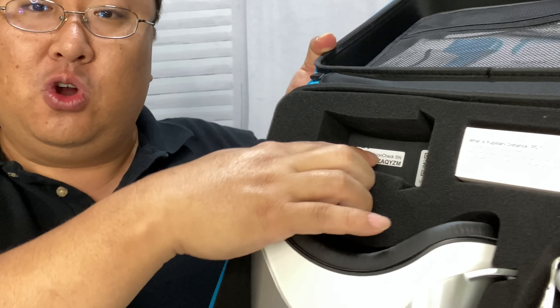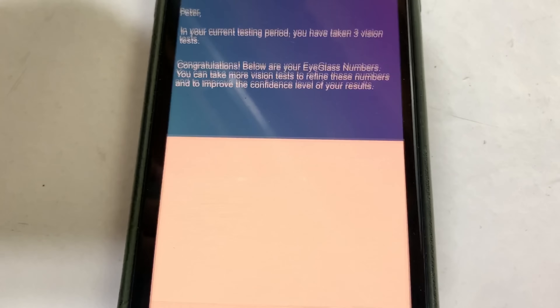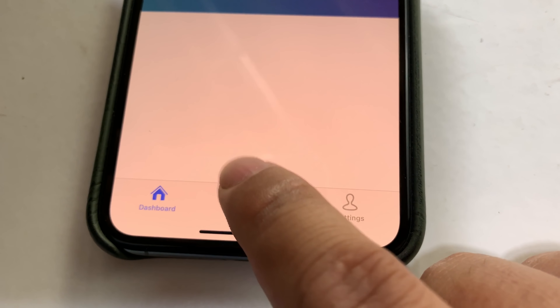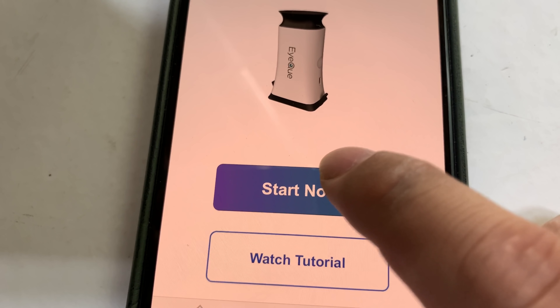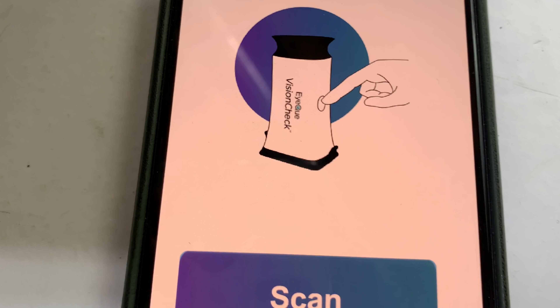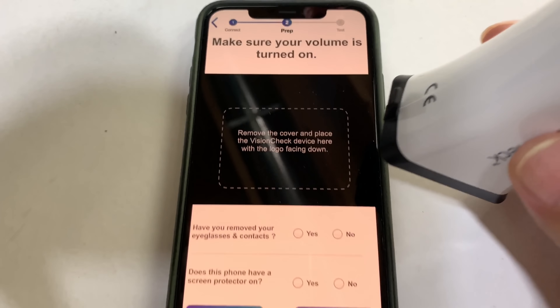That code is just to validate that you've actually bought this, and then you can set up an account and start using it. This little device takes a little while to figure out, but it's not bad. Once you open up the app and connect this to your phone via Bluetooth, you can see where you're going to place this device into the little square that the app gives you.